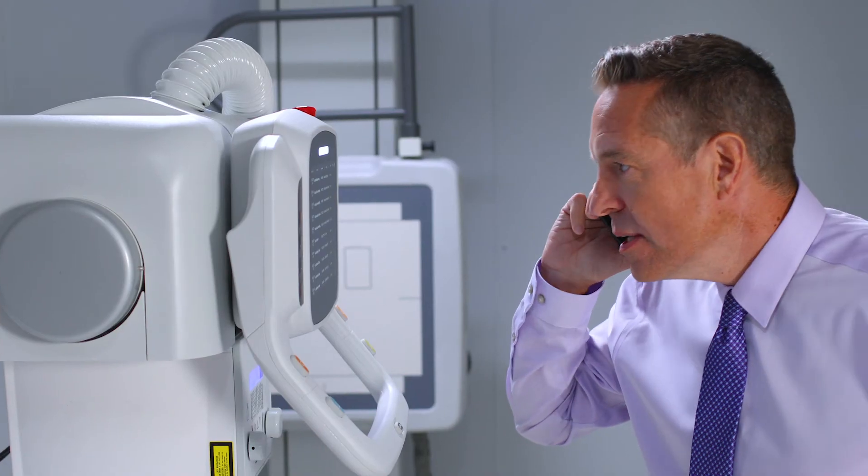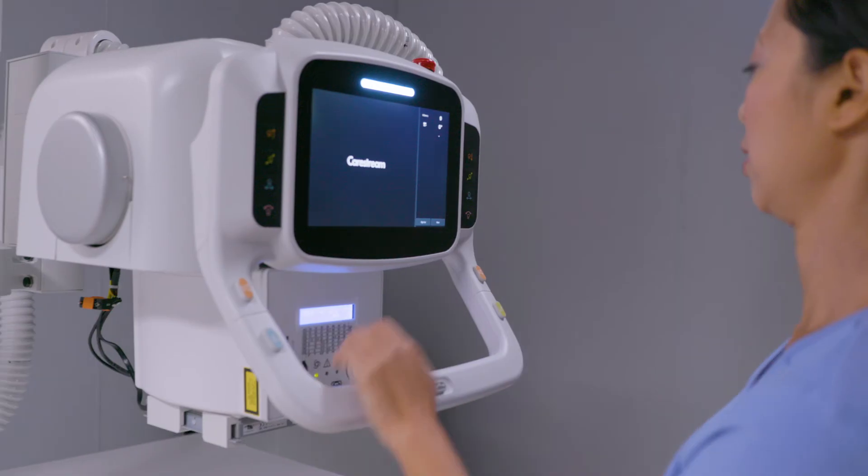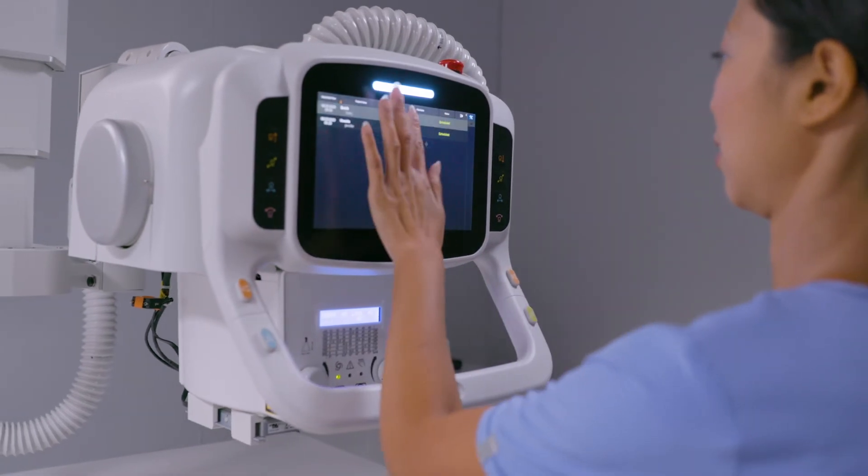This new CareStream system is awesome. We place it in several of our satellite facilities and it uses the same image view software as all our other CareStream systems. That means our training is much faster and easier, and it allows us to rotate our RAD techs to wherever they're needed with zero downtime.